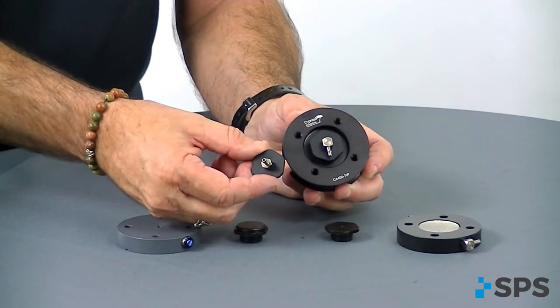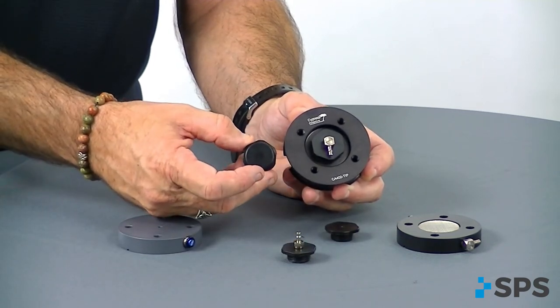So depending on whether you just need an expulsion valve, or you're going to run that through your componentry for an elevated vacuum or HV vacuum system.